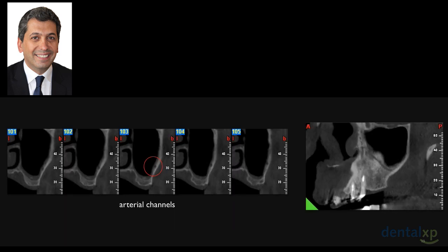Also, we have to detect some arterial channels. And as you can see on this CBCT cut, you see this small arterial channel that you see here. You can see it here.